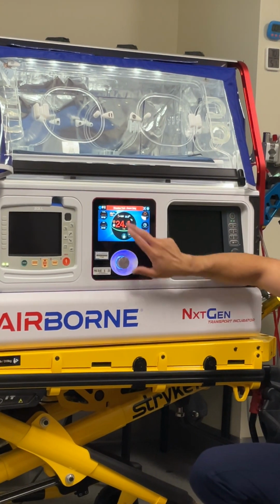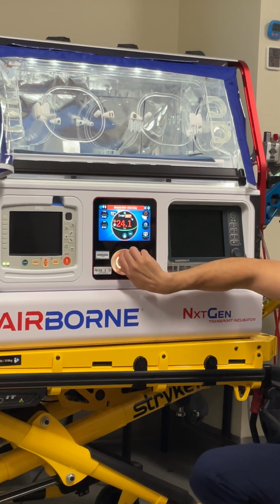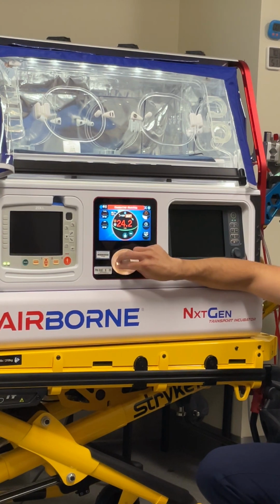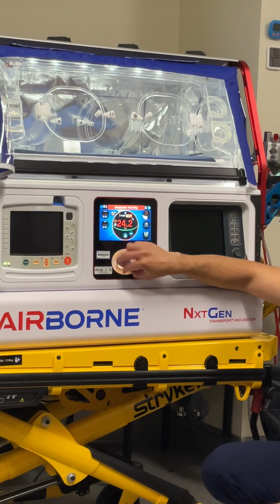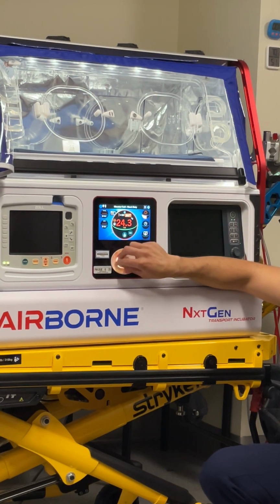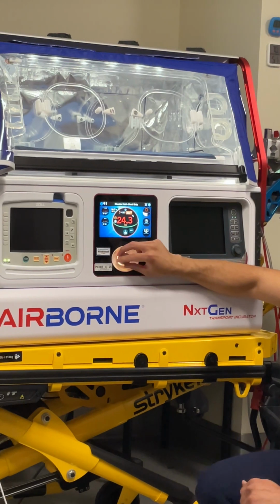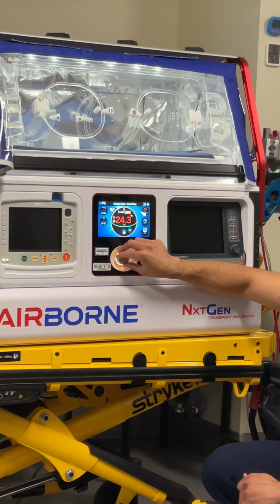So then we go to the center chamber. Now I can actually touch to set the temp we want. So if I want it to be 33.5. It can go pretty low too. I think it goes down to 17; we did it yesterday. So it can go in both directions. Will it blow cold air then? Well, if it's going to 17, it's going to whatever it gets to that temperature. So it's going to target that.